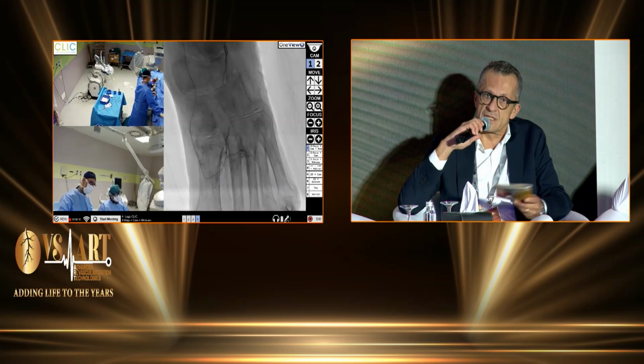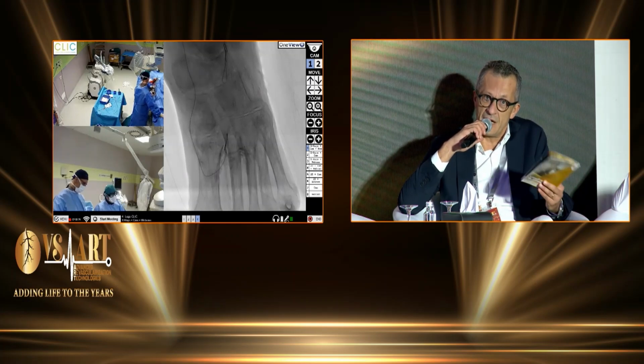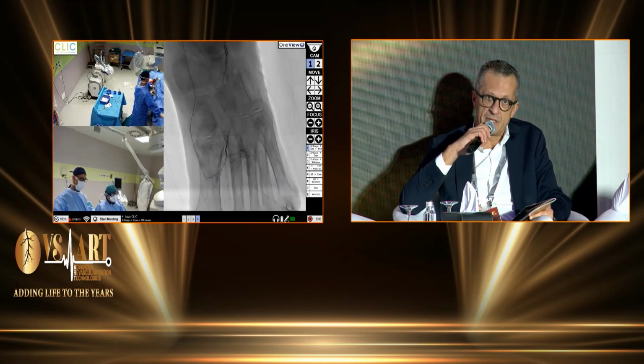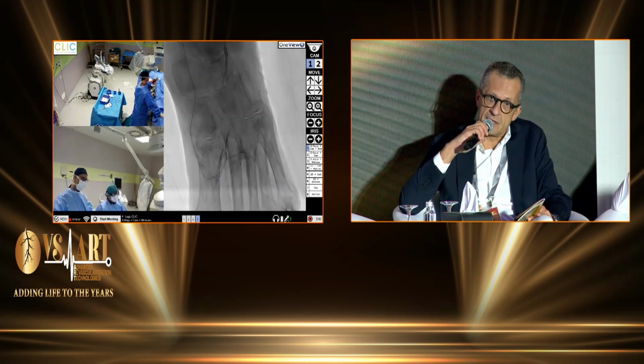When we treat this complex patient, of course, if you treat an SFA with a 3 artery below the knee, it's impossible to see the slow flow. But I think for our daily practice patient, it's really, really important. So I hope the new generation, so sirolimus balloon, helps us to avoid this.